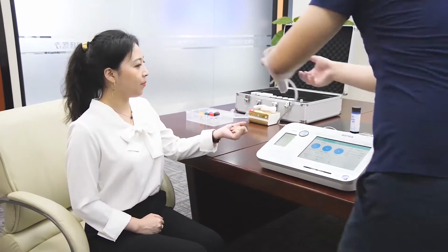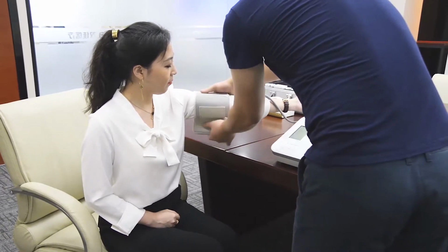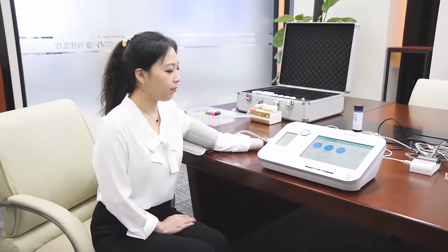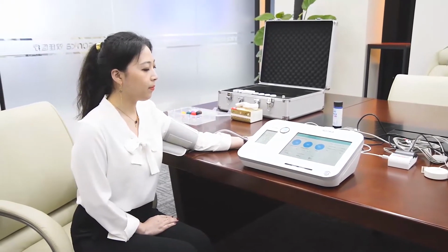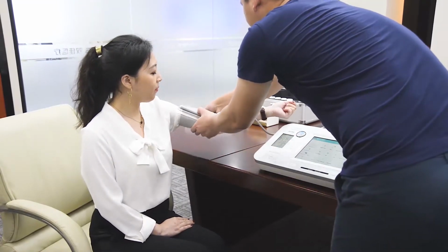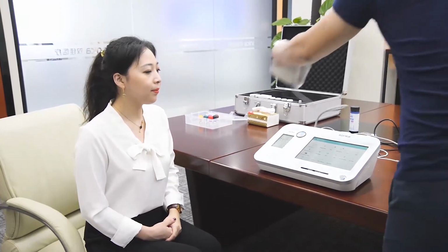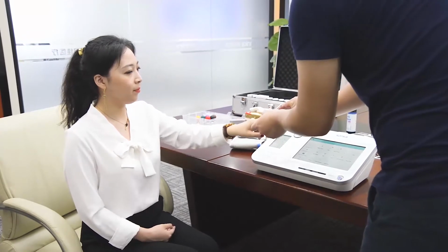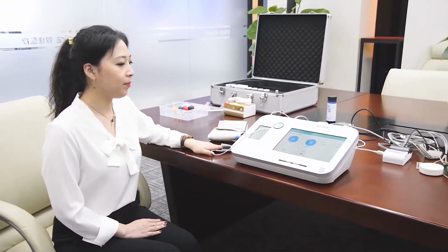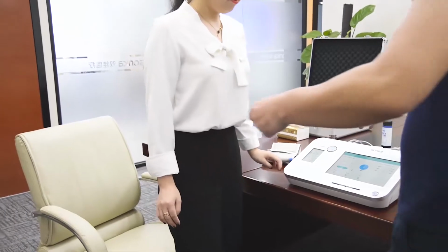The blood pressure. Okay, it's finished, and we go to next step. Next one is blood oxygen, and put your finger inside the clip. Okay, finished, and next one, waist and hip ratio.